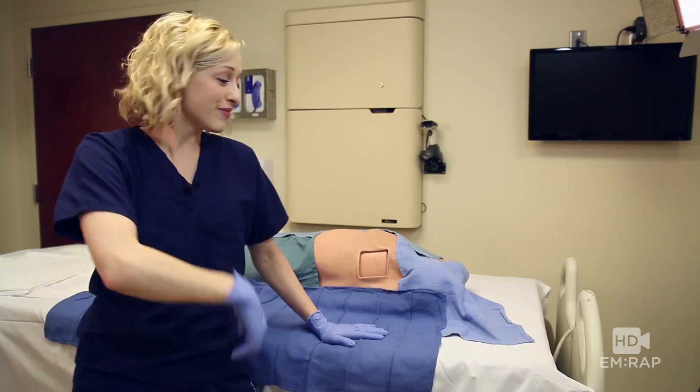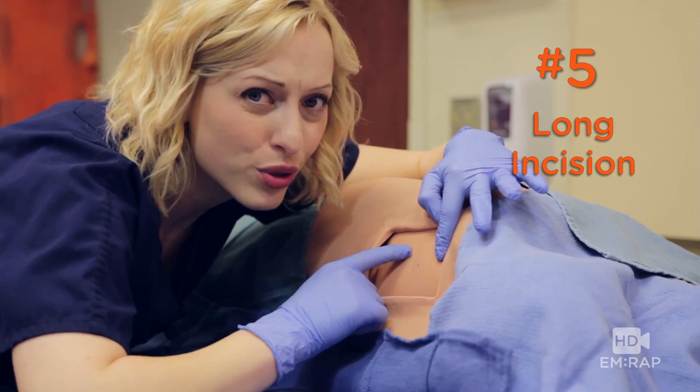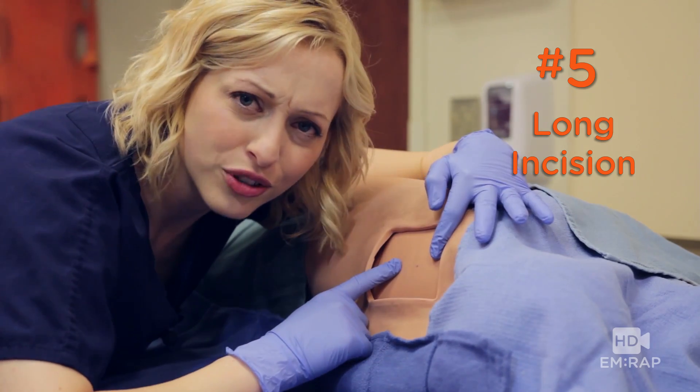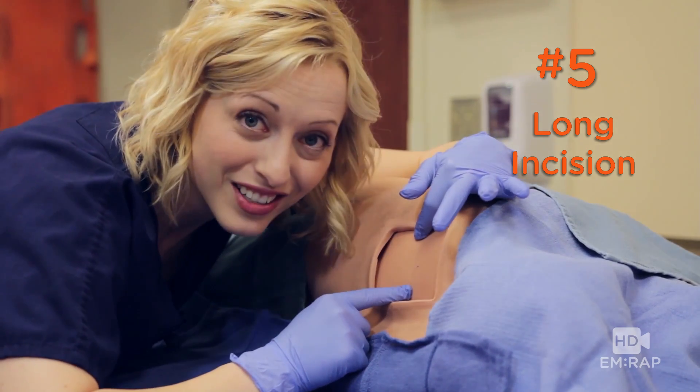Number five: make sure your incision is actually long enough. You don't want to fight your way through too short of an incision. Just like Dr. Herberg says, incisions heal from side to side, not end to end.